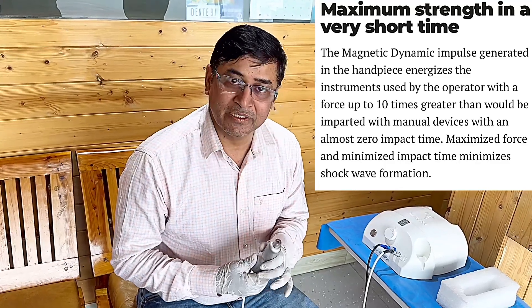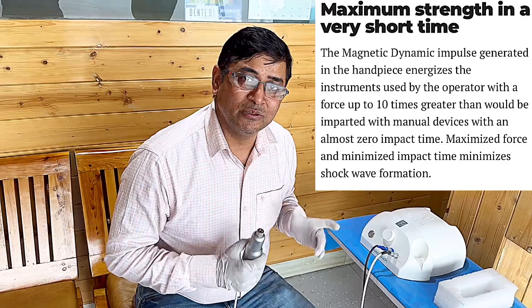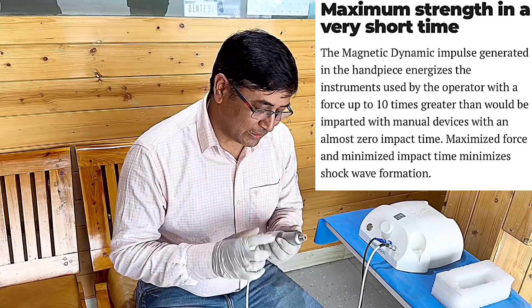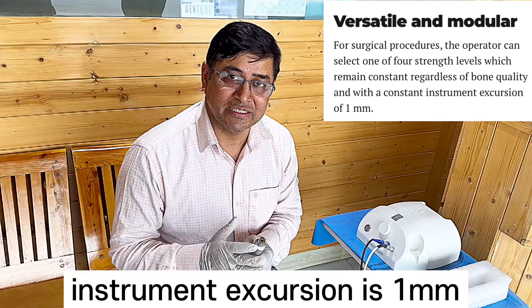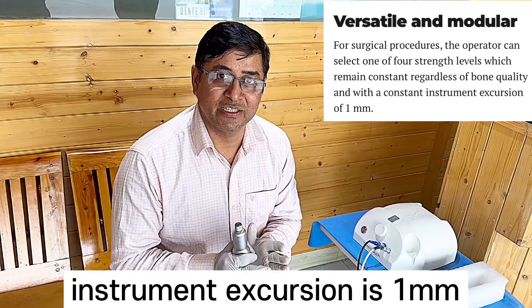Talking about power — with this setting, you know exactly how much power is going to be delivered, so it is under your control. The second thing is the chisel movement is very precise: 1 mm per shot — not more, not less. Very controlled. So you know exactly how much power will be applied and how much movement will occur — this is also fully in your control.